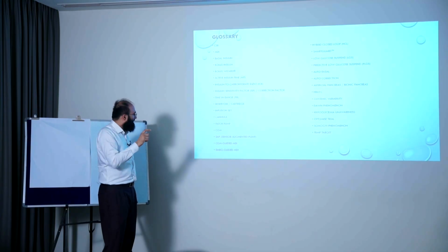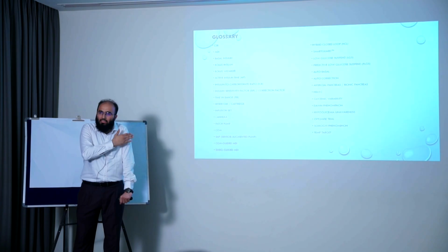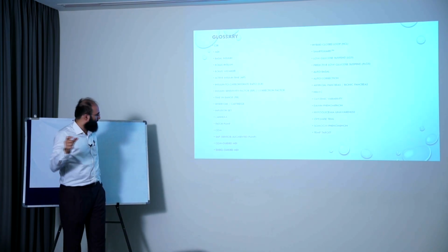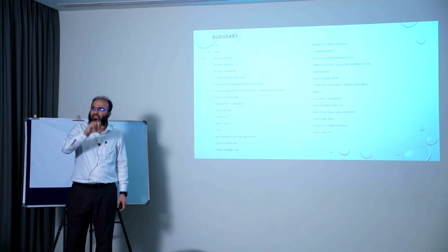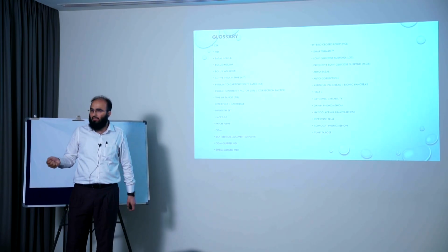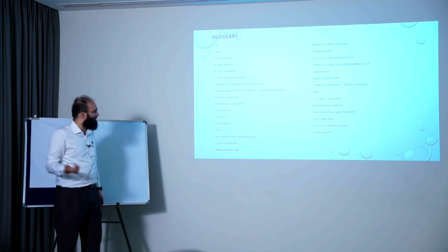CGM guided MDI is multiple daily injections a patient is taking and he is using a CGM to guide his dosages. That's a CGM guided MDI. And SMBG guided MDI is self-monitoring of plasma glucose is being done. Say he's taking his sugar 7 times a day, 10 times a day, and he's adjusting his insulin dosages and taking that insulin externally through a cartridge or a syringe.